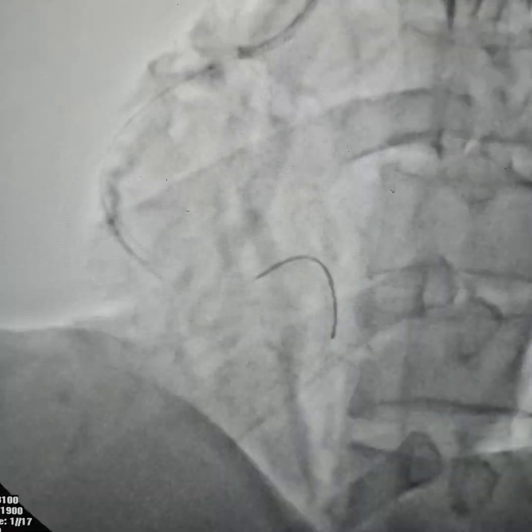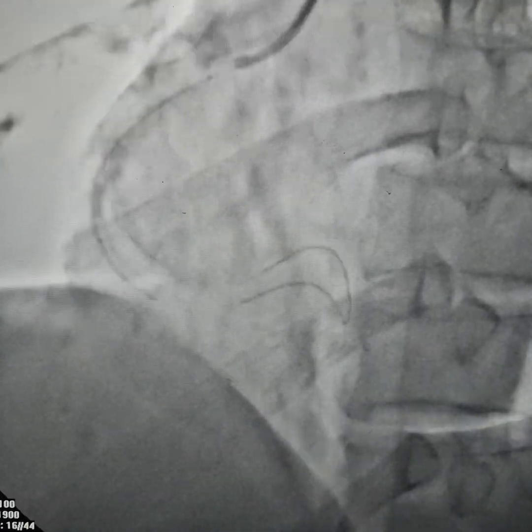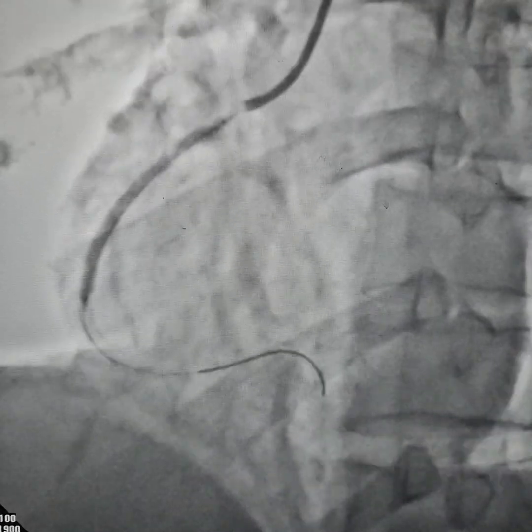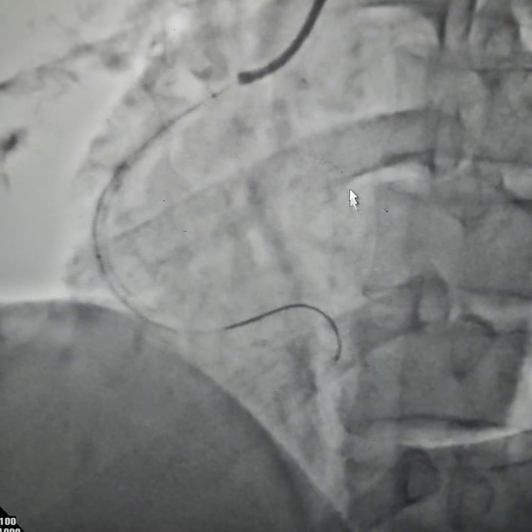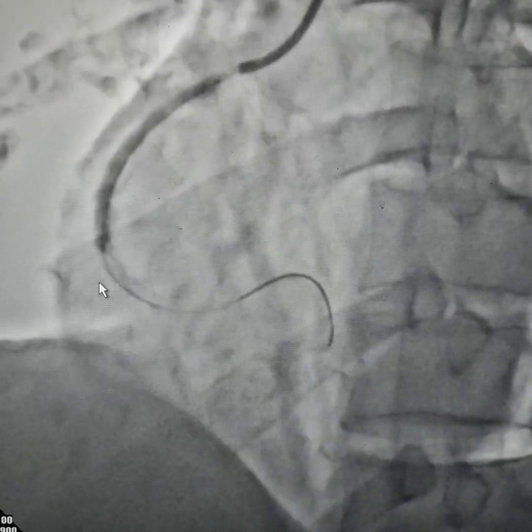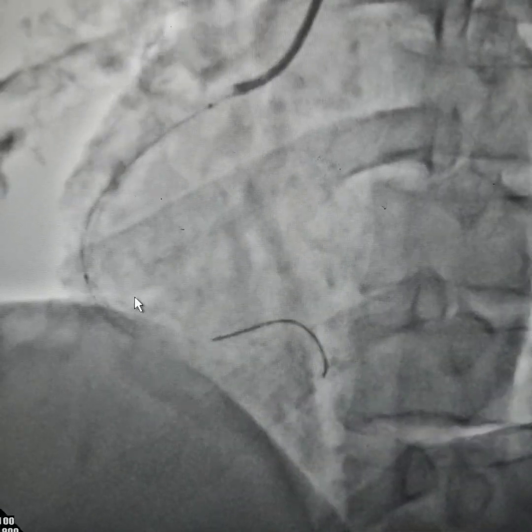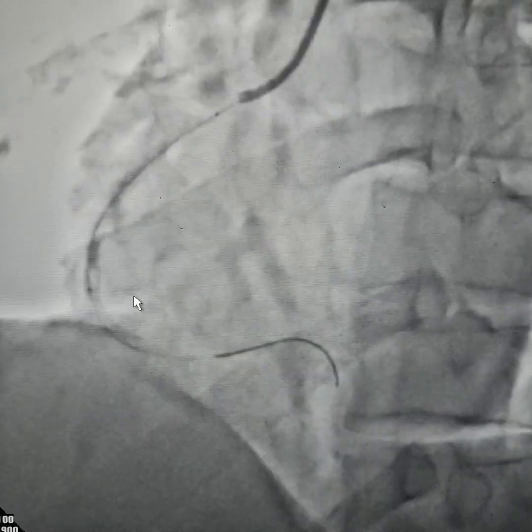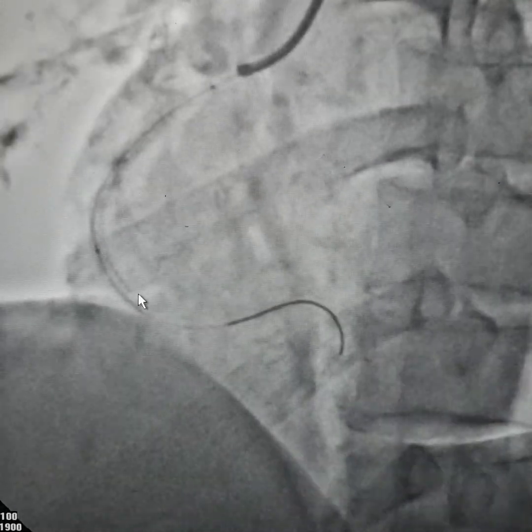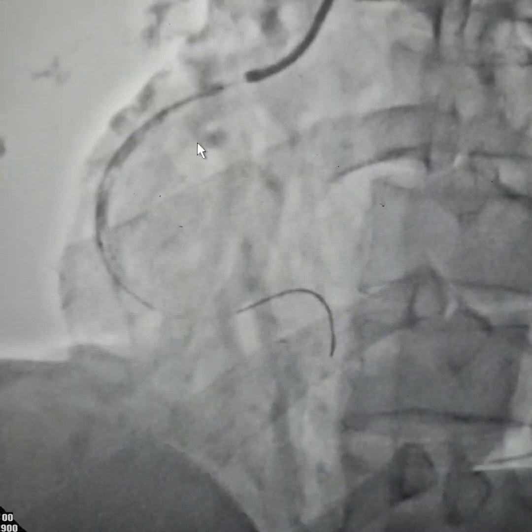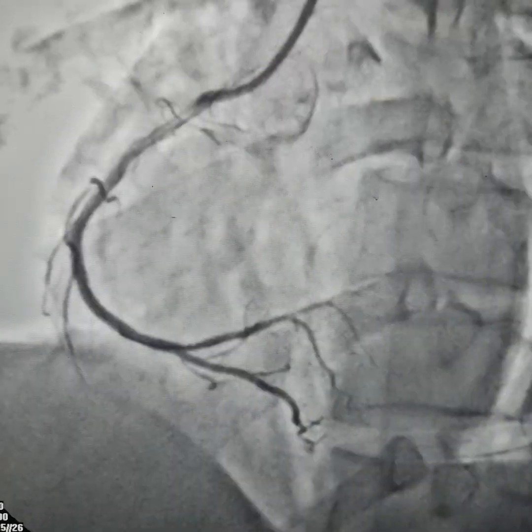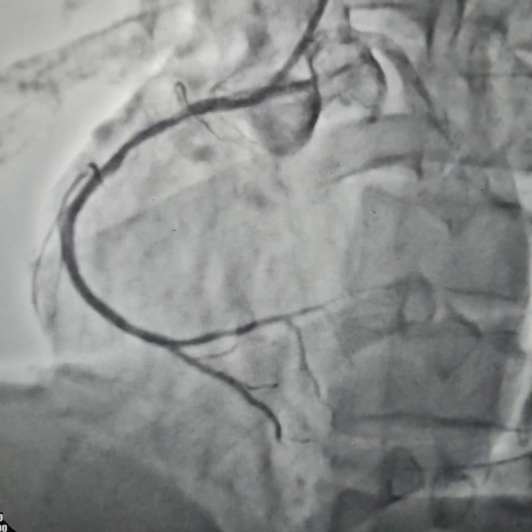We're doing some pre-dilation with the stent balloon only, which also helps us measure the lesion. This is the stent balloon, and we've also pre-dilated the proximal segment with it. This is after the pre-dilation.